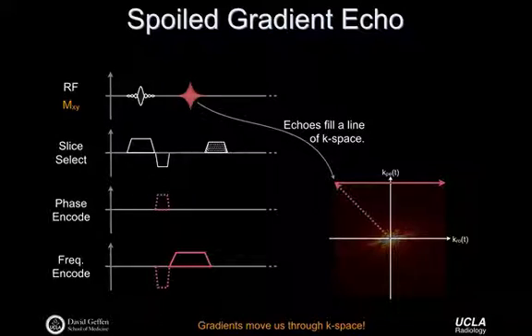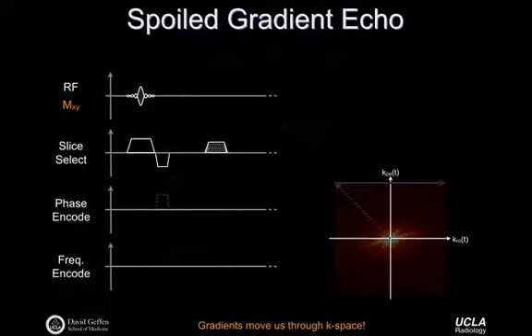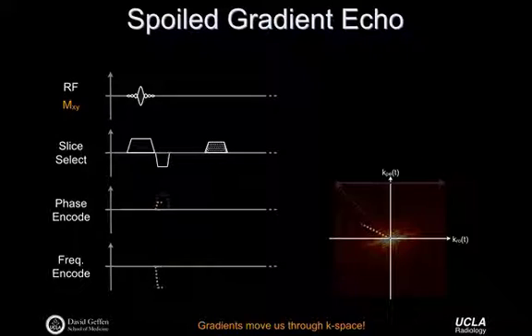We know what our phase encoding gradients are. We know where this line of k-space belongs in some matrix, right? We slot it into the highest element of our matrix, for example. But there's lots of these steps. We have different phase encoding steps that could move us out to a shallower position. This gradient is half its height, or rather half its area, and half the area won't move us up quite as high, but we still have the same negative gradients, and we still move just as far to the left.